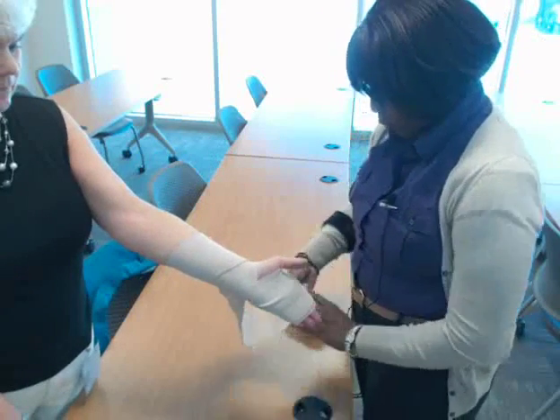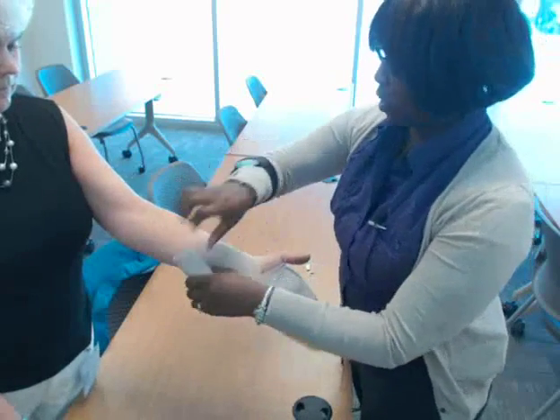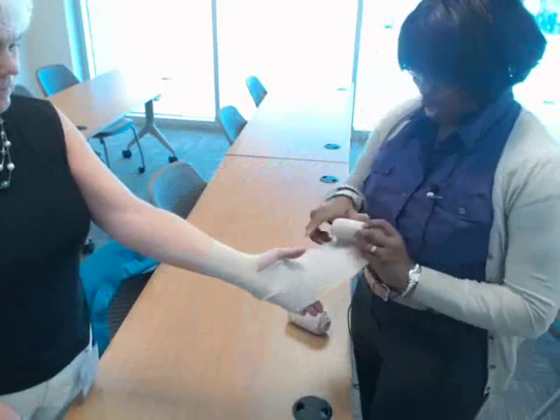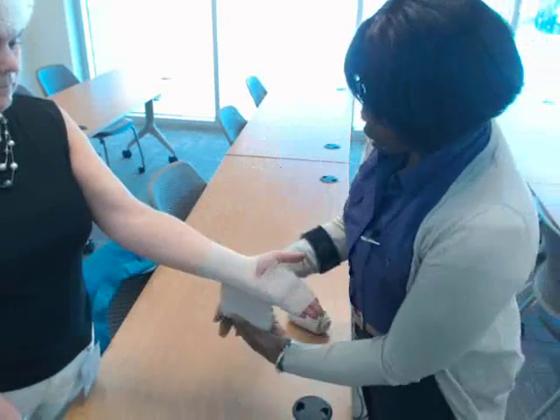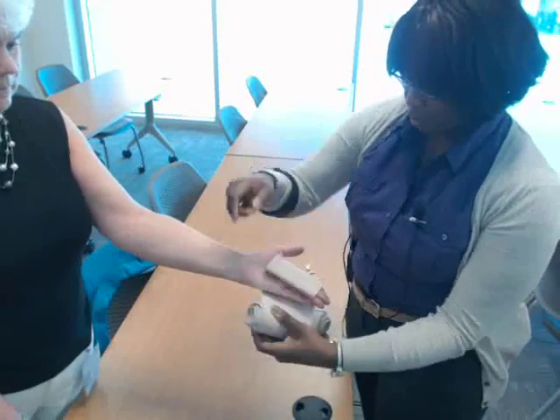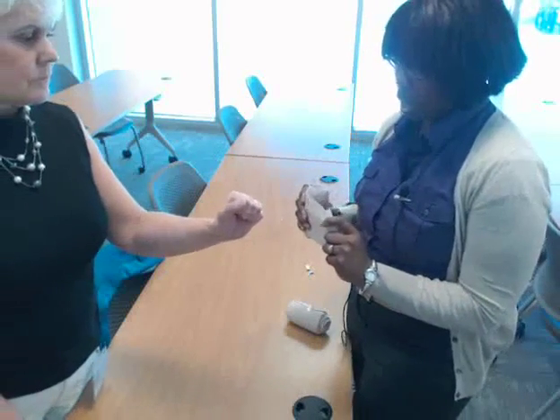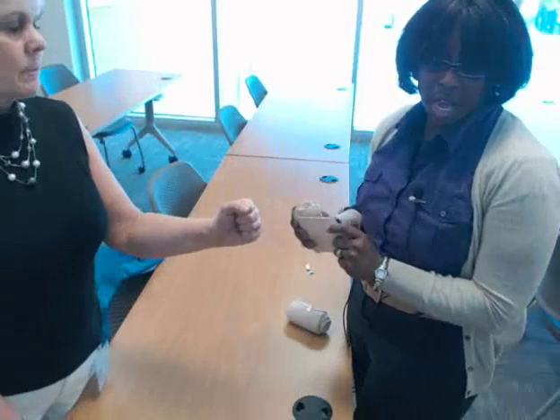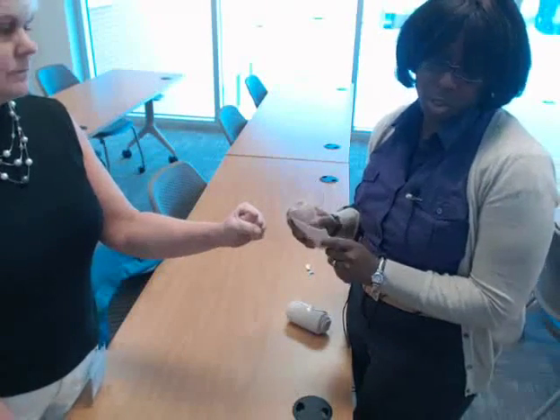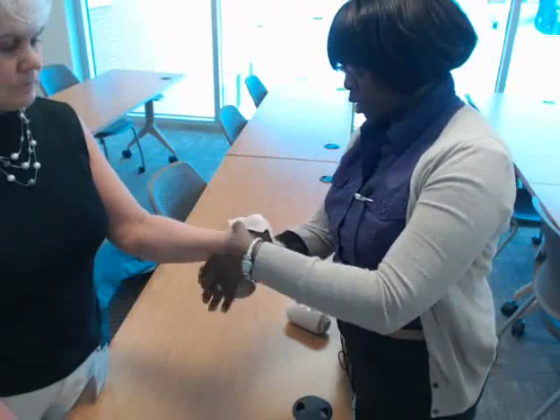Also want to go over the recurrent bandage. The recurrent bandage we usually use on stumps, and we also use them on a hand if we need to. We can also use them on a foot — it depends on what kind of wound you have. So I want to start again with my basic circular turn.